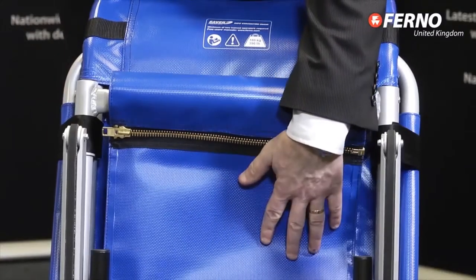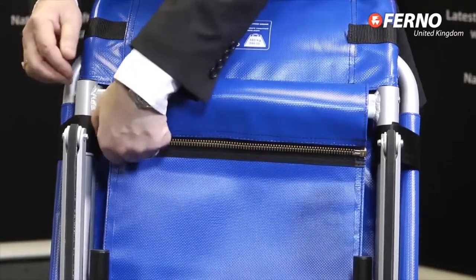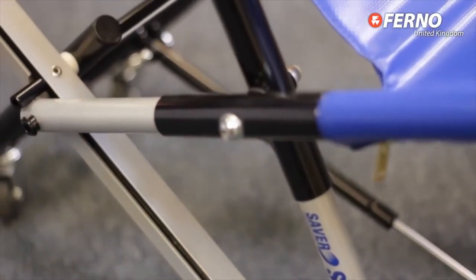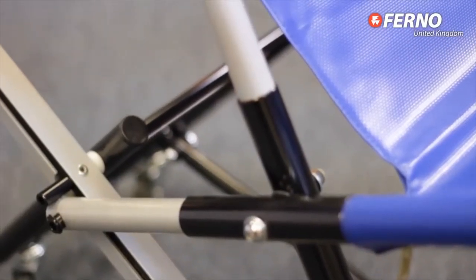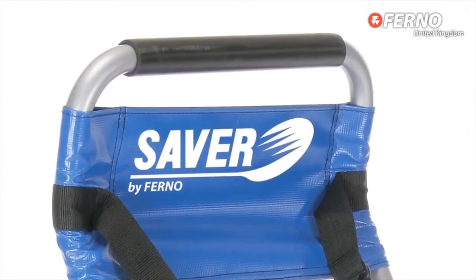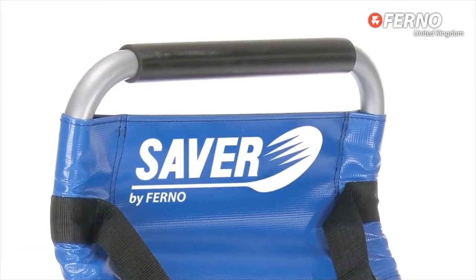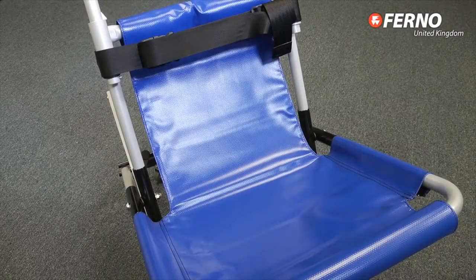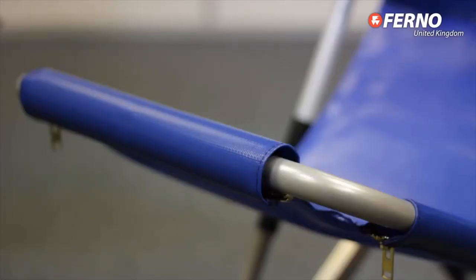The seat is covered in flame retardant vinyl and can be completely removed for cleaning. The frame itself is sturdy and coated in high quality epoxy powder silver paint. An adjustable easy grip handle makes it easy for the user to control and, as the seat is attached all around, it means the patient can be transferred to the side or to the front.